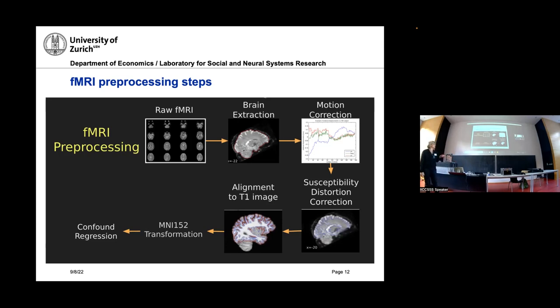But for the first part, we have to align these different images. And this comes with quite heavy algorithms. Here you really do warping algorithms to bring them together, because they are really totally different.